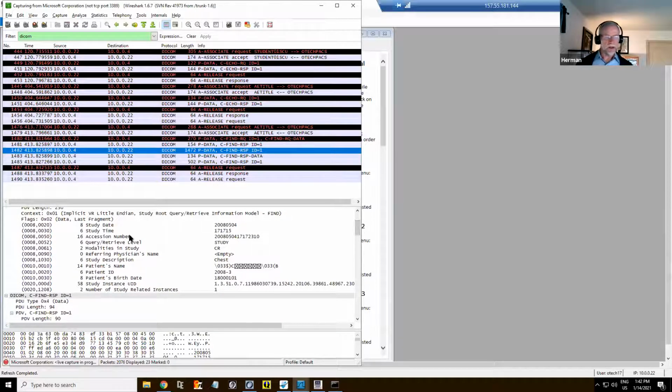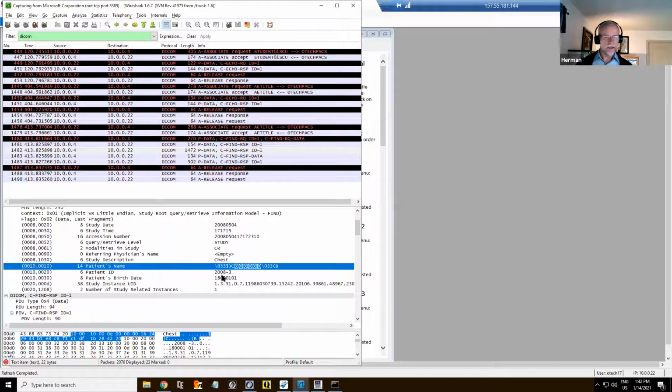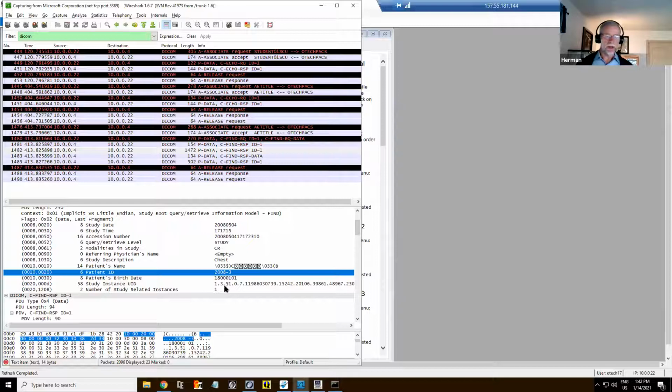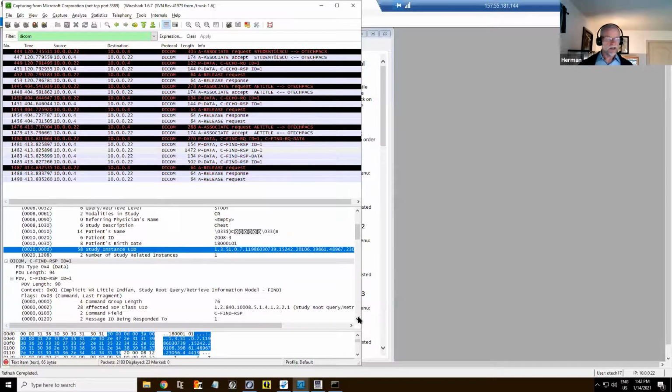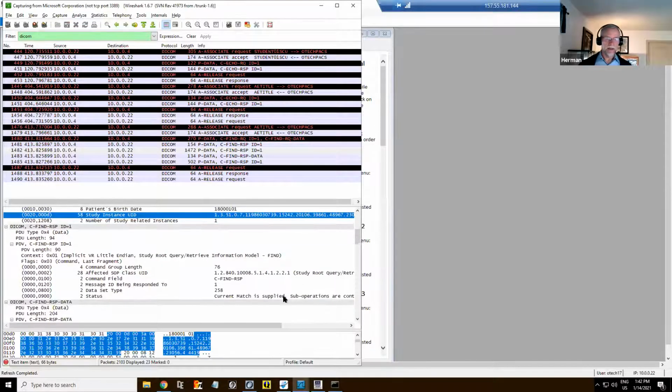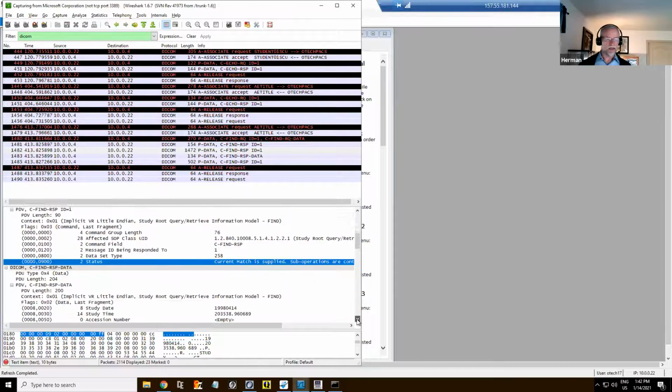Sure, yeah, I got my accession number, and I got my study, I got the name, right? Patient ID and patient birth date, study instance UID, very important because that allows me to pull over the study if I'd like to retrieve it. And then what's the status? Pending. So it says there's going to be more coming. Okay, then we get my next one.